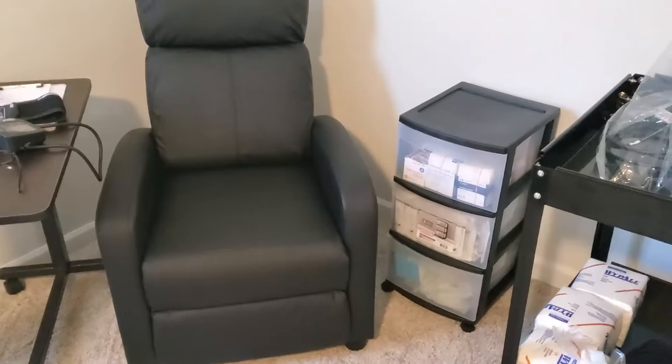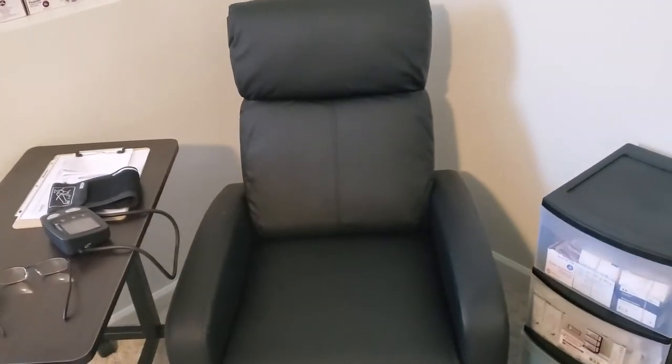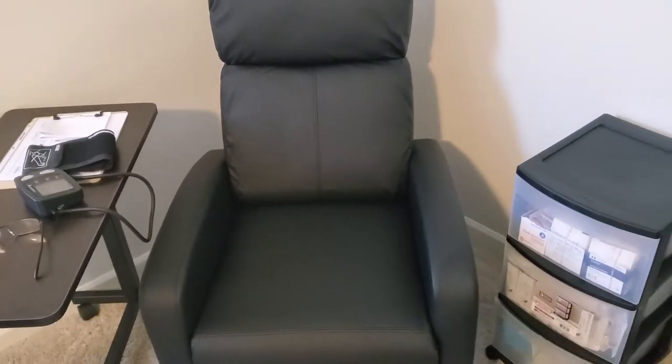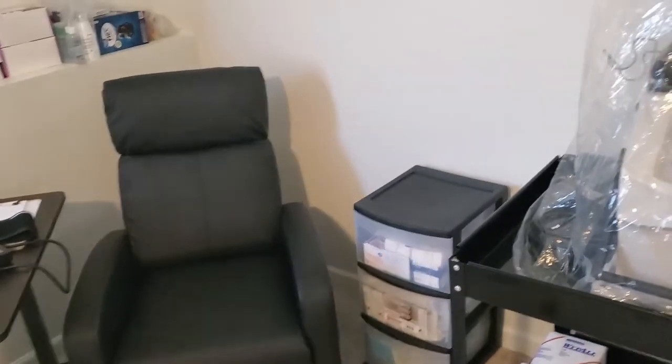I bought me a chair from Walmart, just like $119, $120, something like that, just so I can sit down and run my dialysis. A little table there. It's a nice little setup.